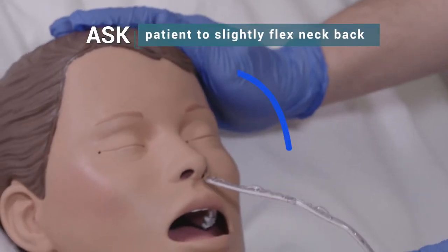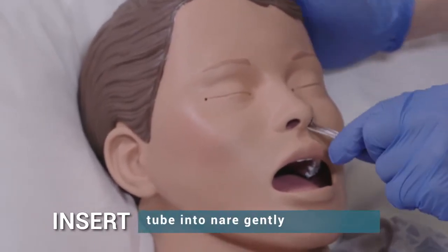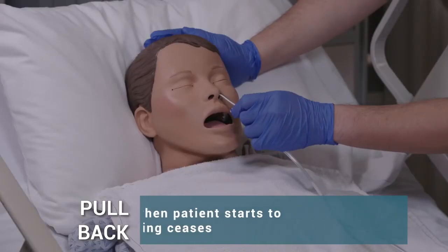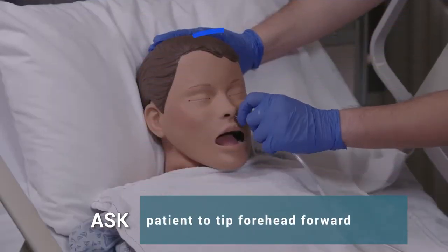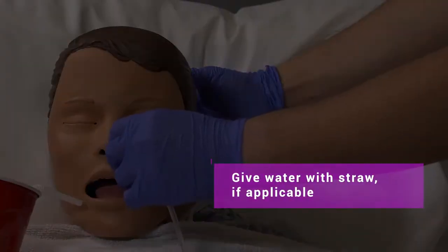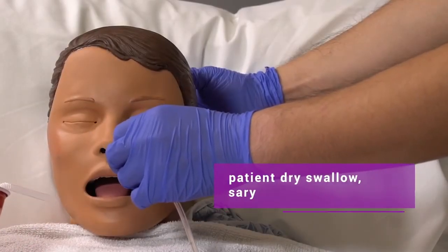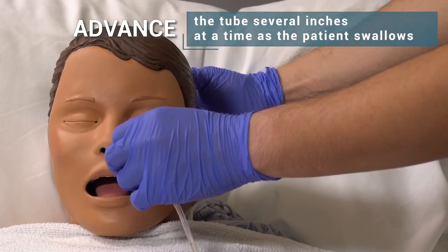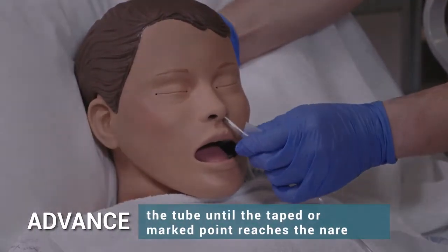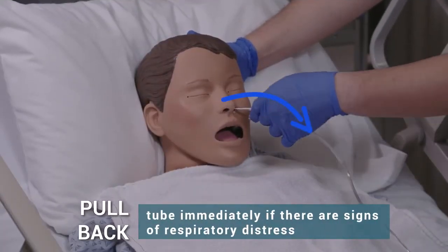Ask patient to slightly flex the neck backward. Insert tube into the nare gently. Pull back tube slightly when patient starts to gag until gagging ceases. Ask patient to tip forehead forward. Give water with straw if applicable, or have patient dry swallow if necessary. Advance the tube several inches at a time as the patient swallows, until the taped or marked point reaches the nare. Pull back tube immediately if there are signs of respiratory distress.